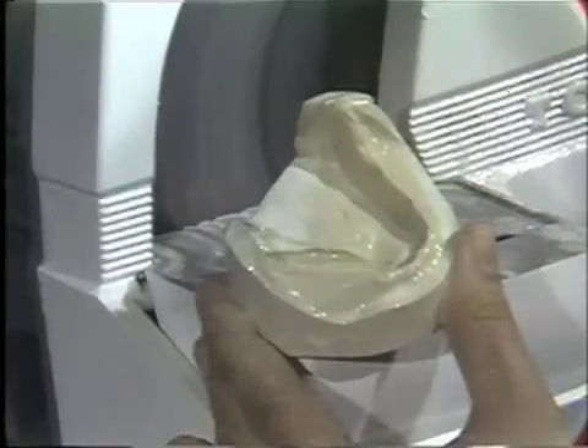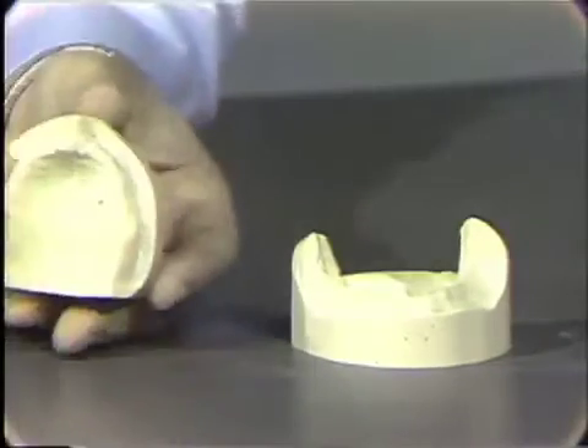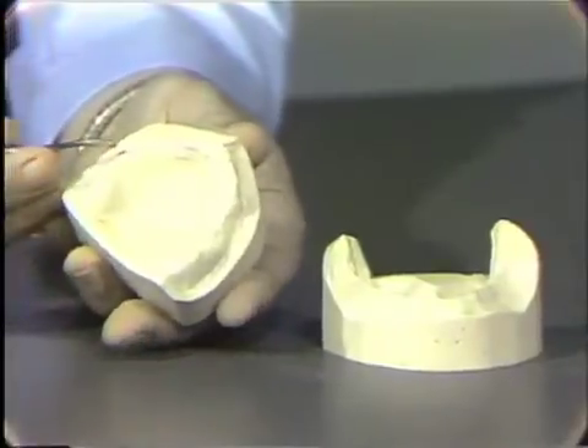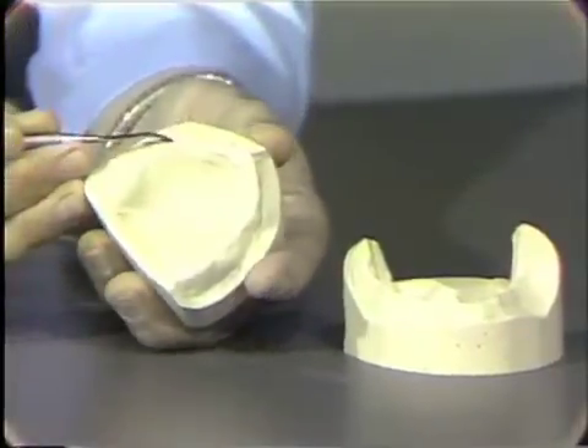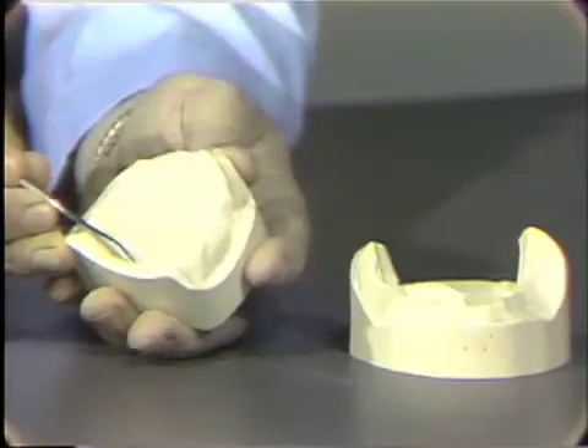Now the final step in the preparation of this working model will be to cleanse the stone model of debris and residual plaster and stone. Using a number seven spatula, the areas of imperfection that one visualizes on the stone here can now be carefully removed by just popping them off very carefully — this large one here.